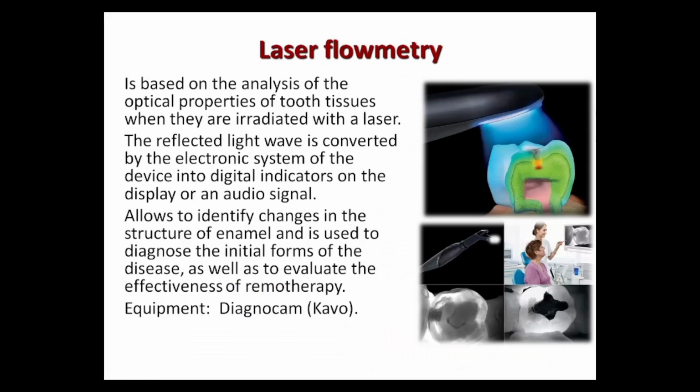And next method is called laser flowmetry. It is based on the analysis of the optical properties of tooth tissue when they are irradiated with a laser.